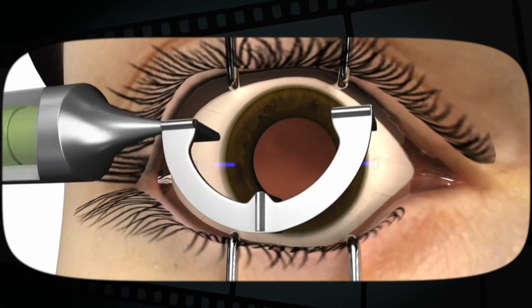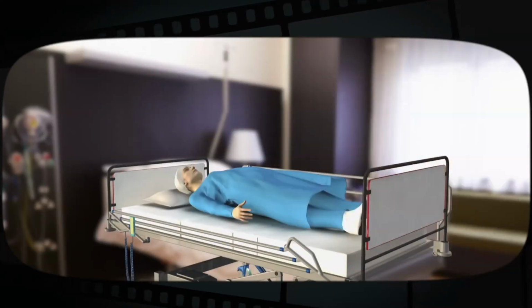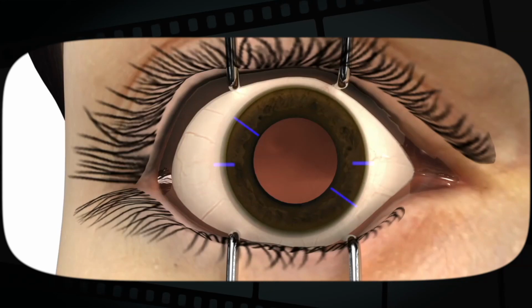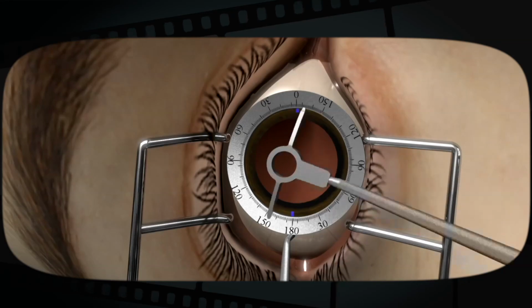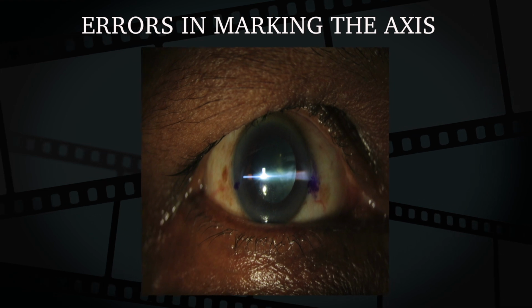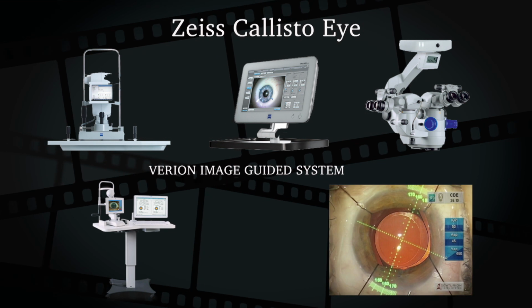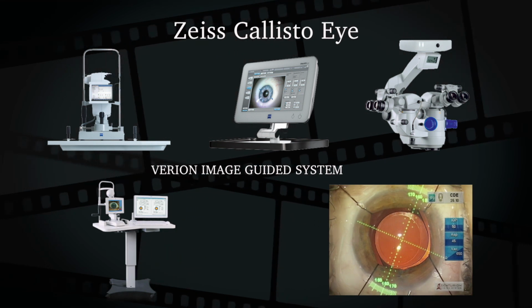Thus, for appropriate toric IOL planning, a 0-180-degree reference axis is marked preoperatively in a sitting position, as supine position leads to cyclorotation in a range of 7 to 10 degrees. To deal with errors in axis marking, a number of image guiding systems are now available and provide real-time intra-op axis guides for correct IOL implantation.